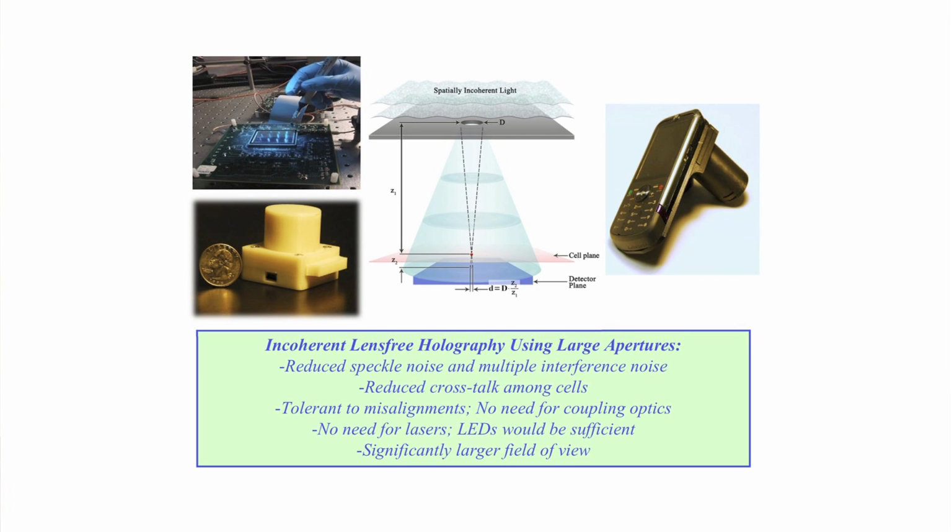It becomes compact, lightweight, at the same time extremely cost-effective. This is just an introduction. I'll show you some more competitive results. This is just a warm-up. Whether it's running on a cell phone, using the cell phone CMOS imager at the back, or a standalone device, the same CMOS as we have in our cell phones, or for extreme field of view, extreme throughput, a CCD that you would find, let's say, in a telescope.